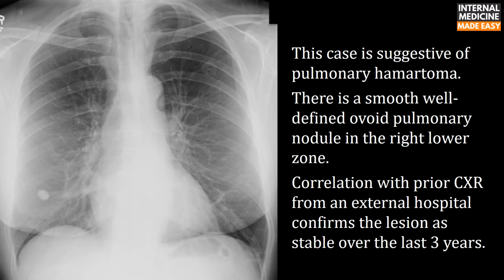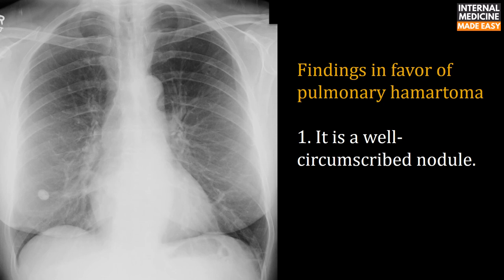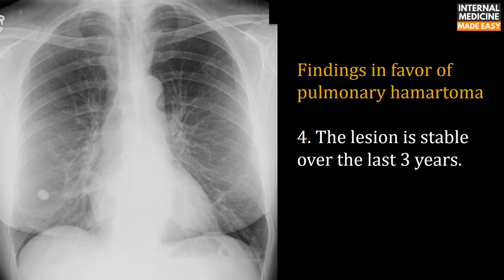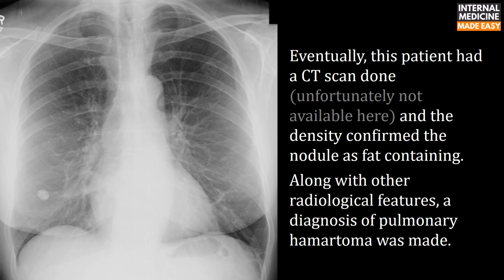This case is suggestive of pulmonary hamartoma. There is a smooth, well-defined ovoid pulmonary nodule in the right lower zone, confirmed as stable over the last three years on prior chest X-ray. Findings in favor of pulmonary hamartoma: it is a well-circumscribed nodule with a smooth margin, there is no cavitation, and the lesion is stable over three years. CT scan confirmed the nodule as fat-containing.